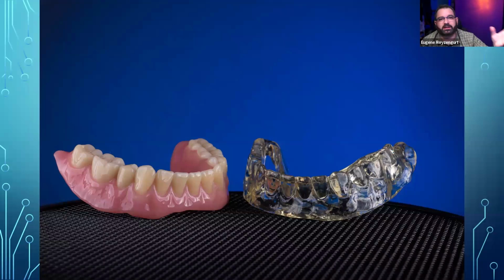That's not a problem. You basically duplicate the denture like I showed you before, and instead of digitally printing it, what I did was duplicate things in a flask, do things with clear acrylic resin, and then by hand grind the trough for the implant placement, and also cut the line for bone reduction levels. And it was really difficult to do because you had to do a ton of grinding. You were covered in acrylic, and it's a pain in the butt.